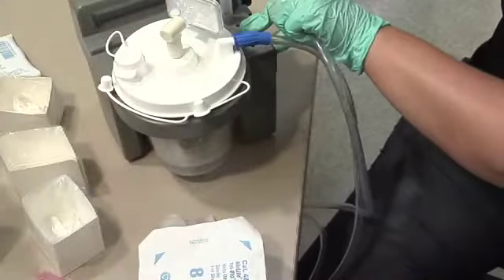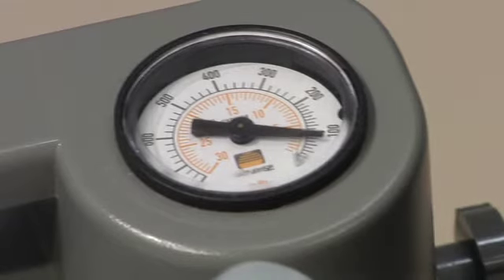Turn on the suction machine and check for its function. Ensure the suction machine has the appropriate level of pressure. Standard maximal pressure for children ranges from 80 to 100 millimeters of mercury. Put on clean gloves.